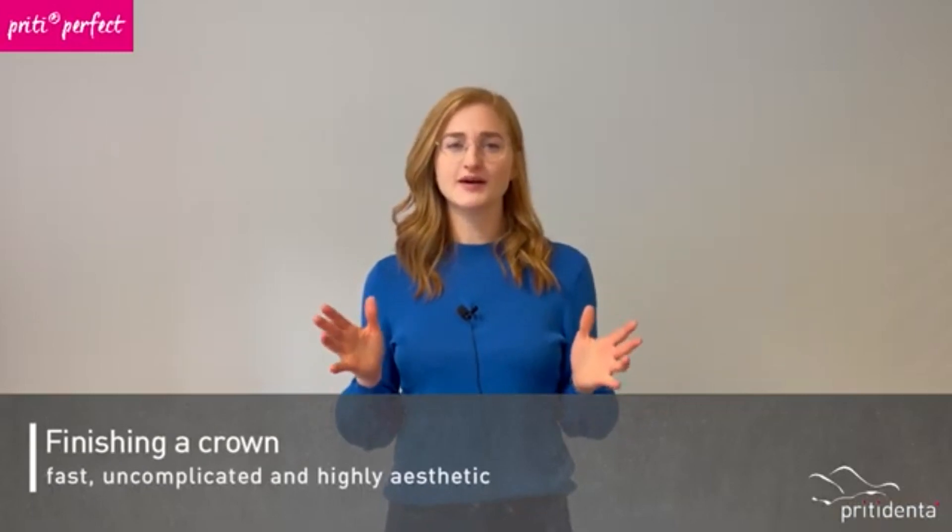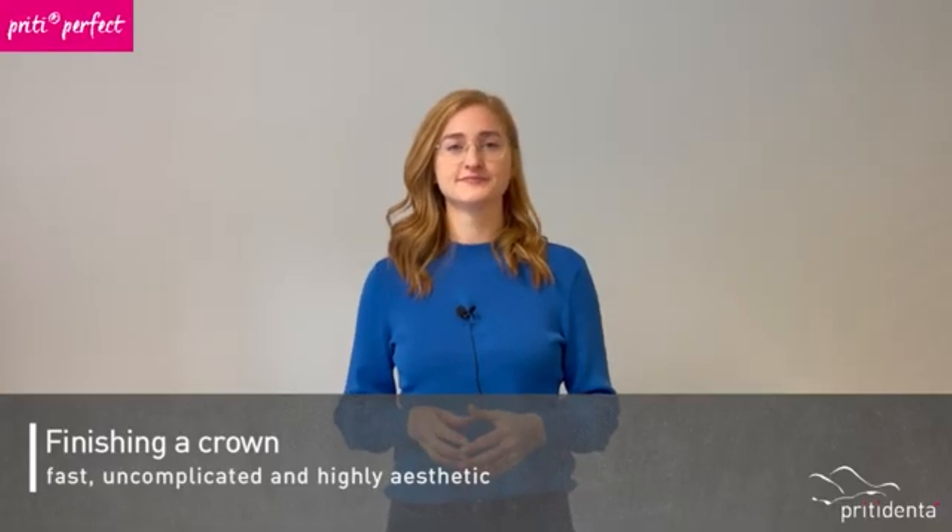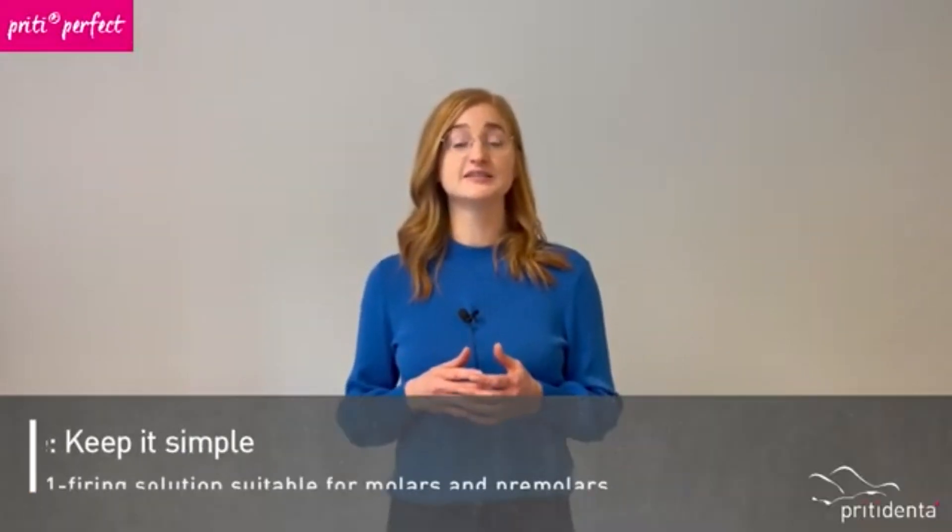Hello and welcome to pritidenta! Today I would like to show you a quick, uncomplicated and highly aesthetic way to create a perfectly finished crown. For this, I will use our staining and structure paste concept priti perfect. In order to achieve a beautiful result quickly, we recommend the keep it simple approach.